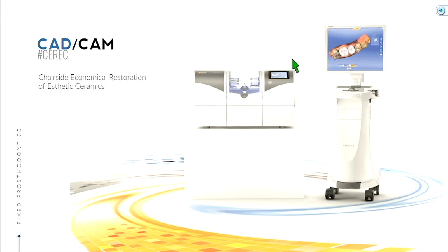And this was a bit of a game changer in the sense that, just like the video we showed, this is the first introduction into a system in which you can get a crown made in the same day. So prior, remember all the steps that we went through to make a PFM crown? Think about everything that goes into that from the time that you make your impression. You've got to pour it up, Pindex it, mount it, then wax it up, then invest it, cast it, and then stack all your porcelain. So it's pretty labor intensive.